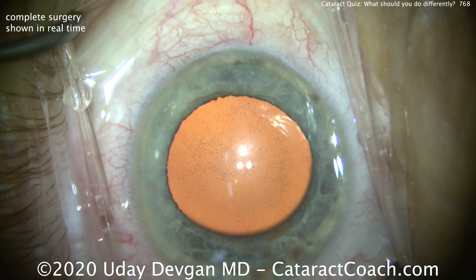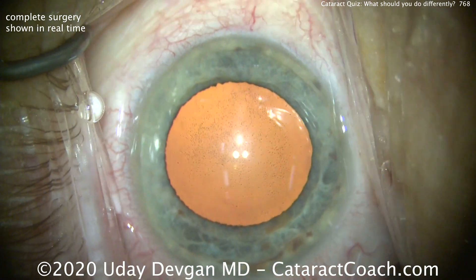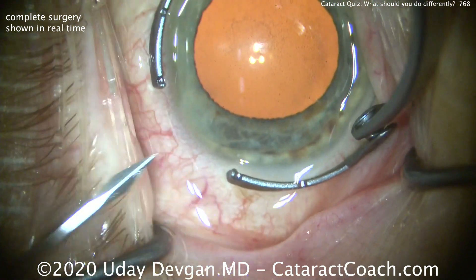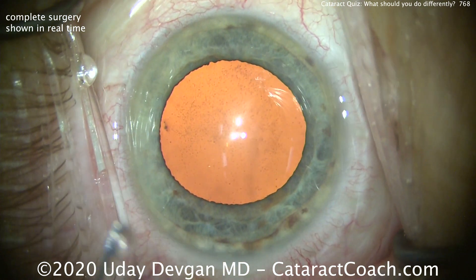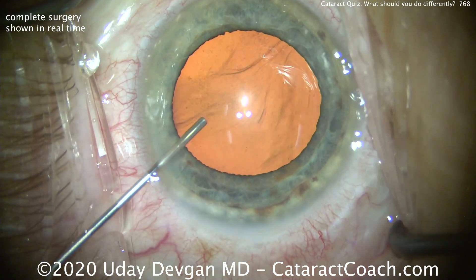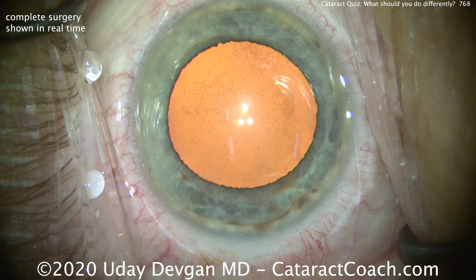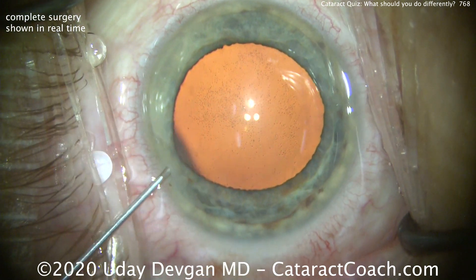Look carefully. This is a patient who has Fuchs Corneal Endothelial Dystrophy, and we can see dropout of endothelial cells. This patient has some effect on vision from the Fuchs Dystrophy and most of the effect from the cataract. We've increased the red reflex in the video to show you those spots from the Fuchs Dystrophy. I'd say 80% of the visual problem is cataract and 20% is the Fuchs Dystrophy.